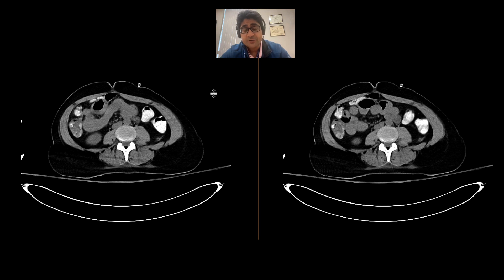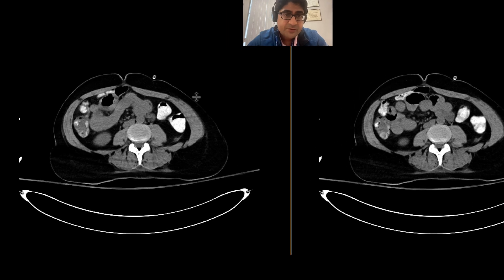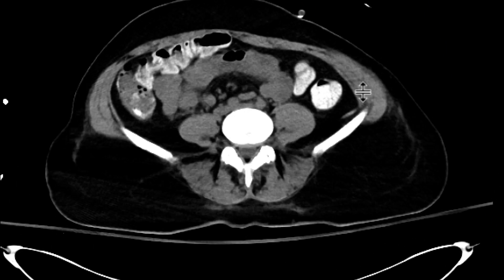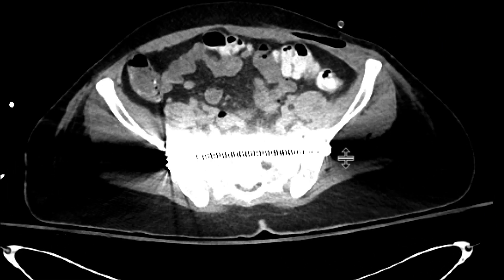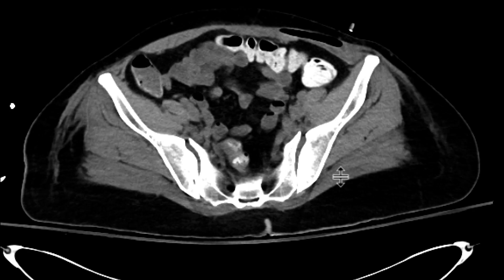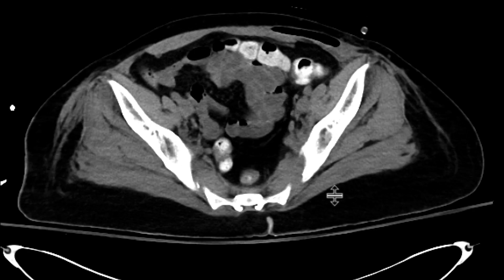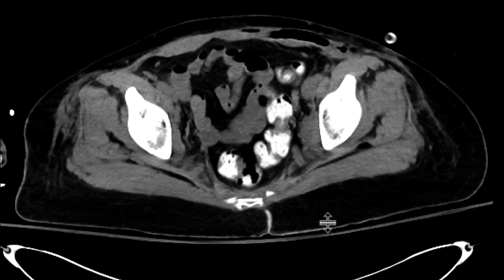This is a patient who had undergone some trauma and they were worried about an injury to the bladder. For this, we did our CT cystogram protocol, which consists of a non-contrast CT through the pelvis. We can already see that there are some repairs from prior injuries to the bones in the setting of this trauma.